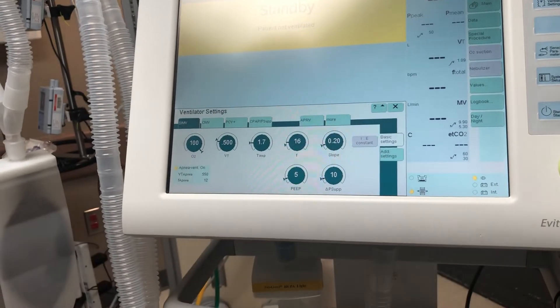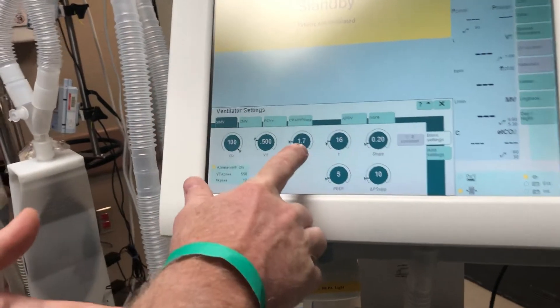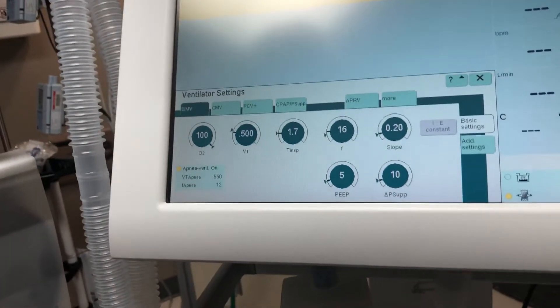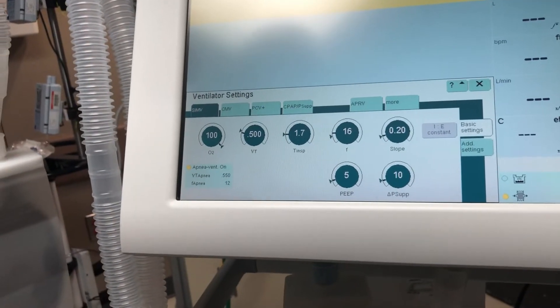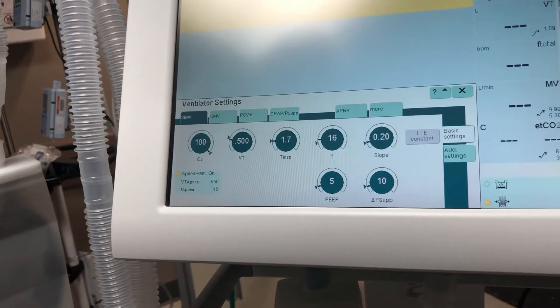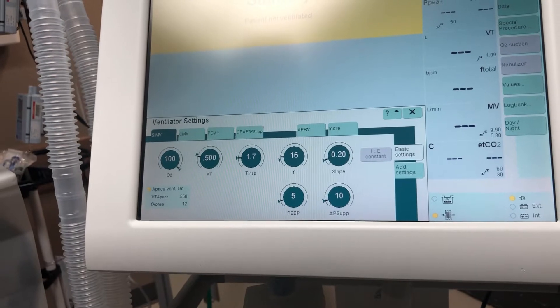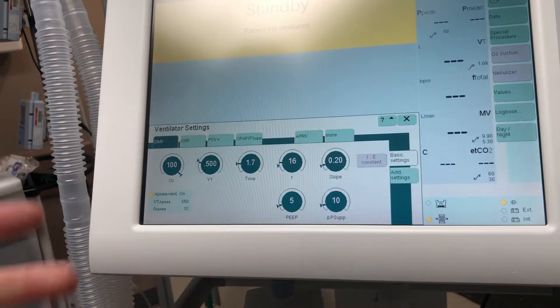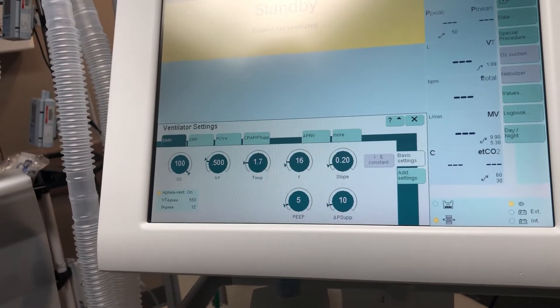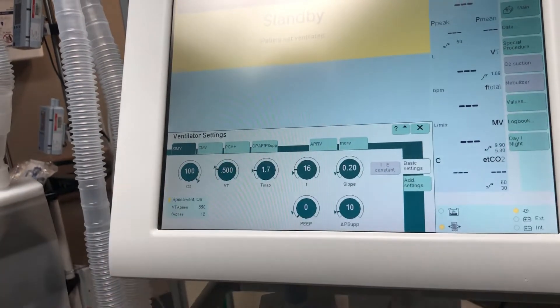Here's your oxygen percentage. Your I-time is at 1.7 — we'll leave it there for now. Your slope always stays at 0.2, which is where we like it to be. And here's your PEEP and also your pressure support. Normally we leave PEEP at 5, but for our purposes we're going to turn it down to 0 and go from there.